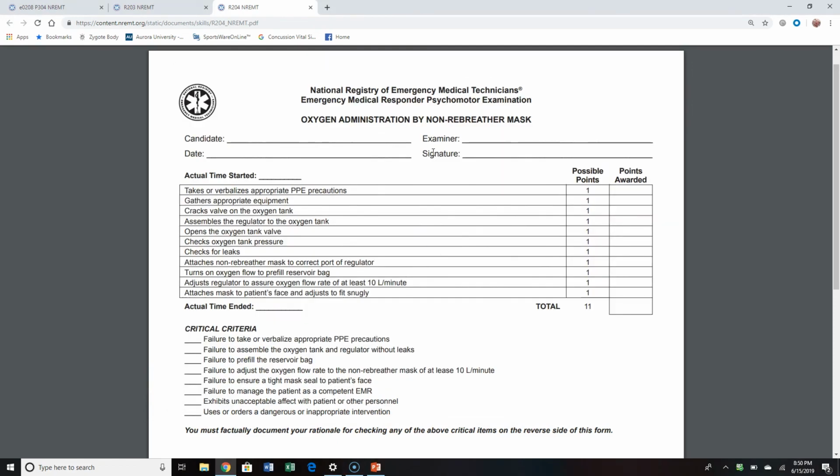But kind of finishing that thought, with our airway adjuncts, we need to be really verifying that where we put them, are they still at the teeth, or at a particular depth marker? Are our pilot balloons still firm if we have those? Verifying still that we have placement through auscultation of the chest, and we should hear clear and equal breath sounds bilaterally. We shouldn't hear breath sounds over the epigastrium, over the stomach. And just, as we said, continue to document that.